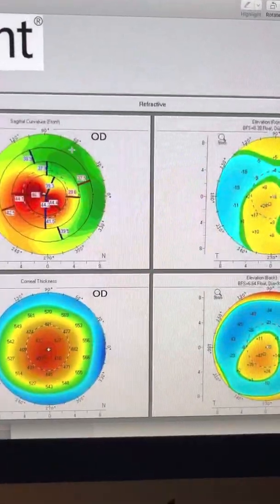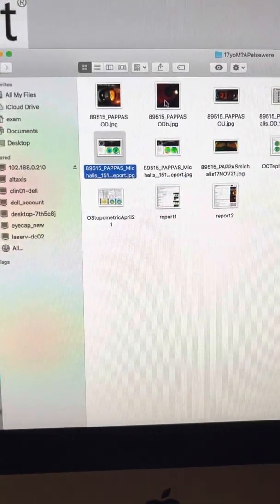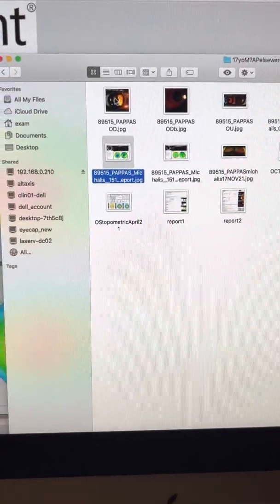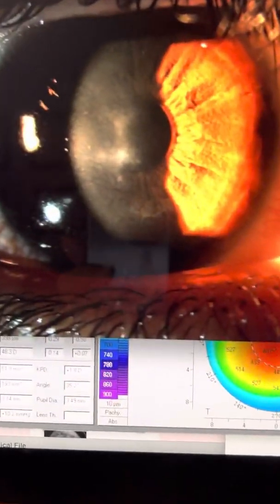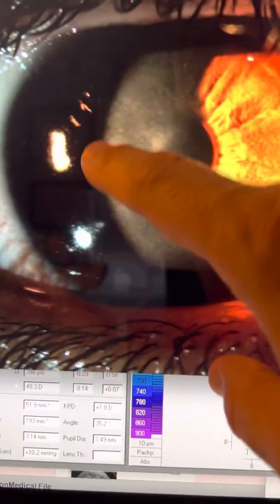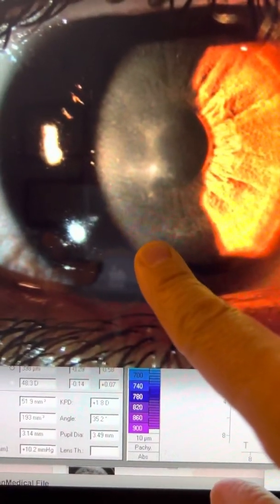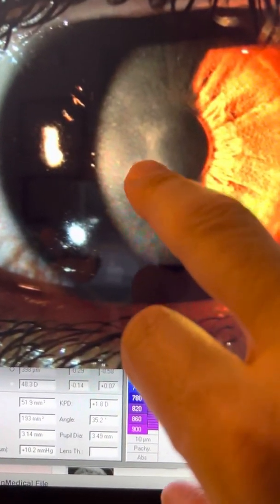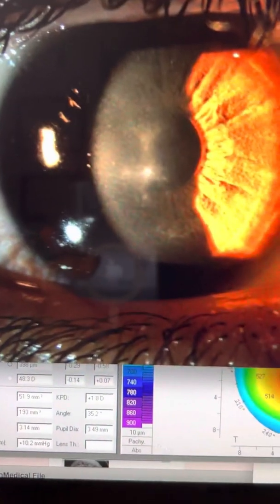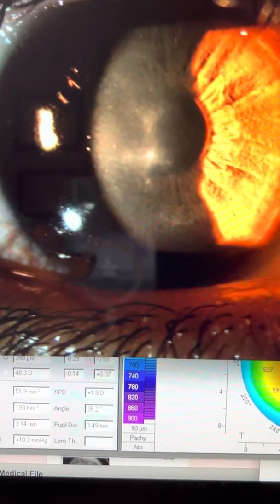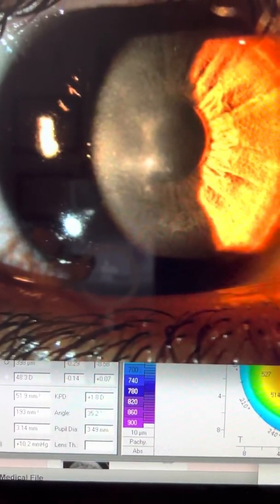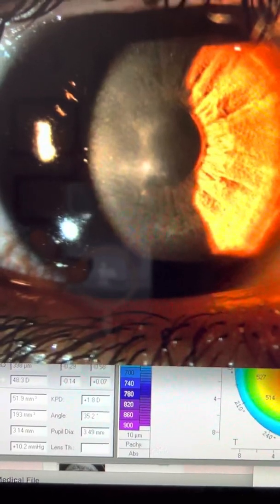And I'm going to go back to that clinical image and discuss a little bit about what I changed in the treatments of this young gentleman. There's some ground glass appearance here consistent with the cross-linking effect. But this, in my opinion, is an epithelial toxicity and an epithelial healing hesitance.